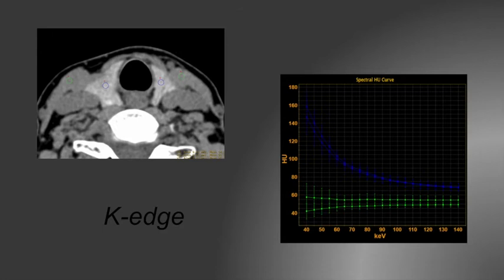This principle explains the characteristics seen on the curve here on the ROI analysis of the thyroid gland. Iodine has a K-edge of 33.2 kiloelectron volts. Therefore, at lower energies approaching iodine's K-edge, there is significantly increased attenuation, as you can see on this image. As a reference, a typical single energy CT would be considered equivalent to attenuations you're seeing at 65 or 70 kiloelectron volts.